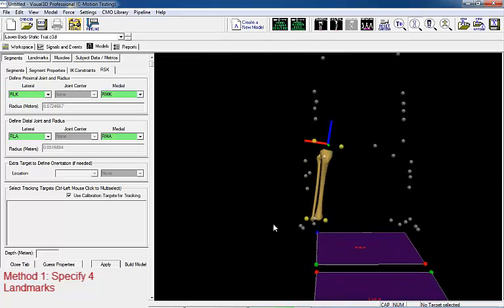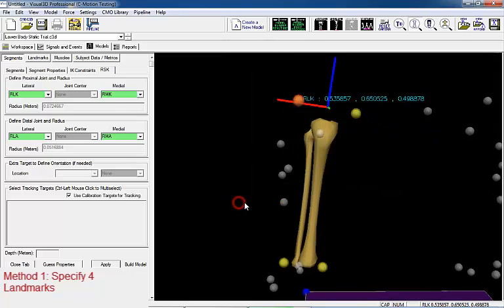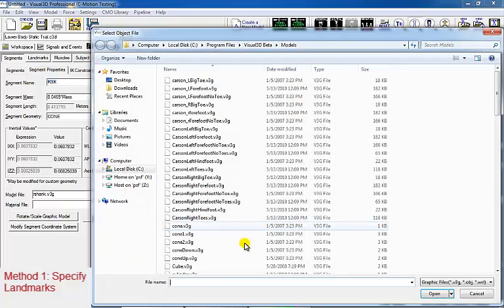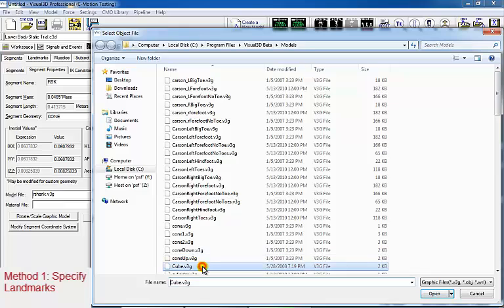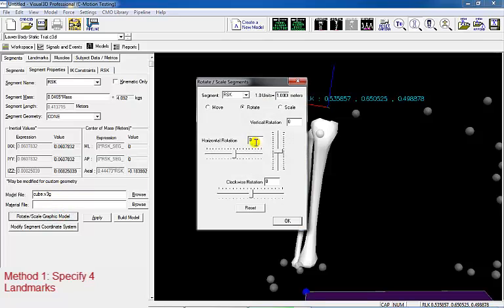To define the segment coordinate system, V3D will follow four steps. First, Visual3D will create an anatomical plane between the proximal and distal targets. In this instance, the knee and ankle targets are not on the same line, and Visual3D will use the least squares method to fit a plane between these targets. To better view the plane, we can switch the image of the shank from the tib-fib segment to an actual plane. The actual image has no bearing on the calculation, so we can modify the model file and rotate or scale the graphic model to whatever we like.